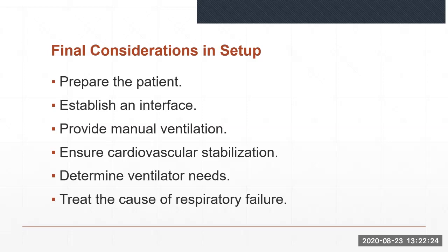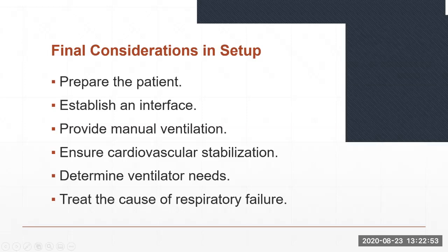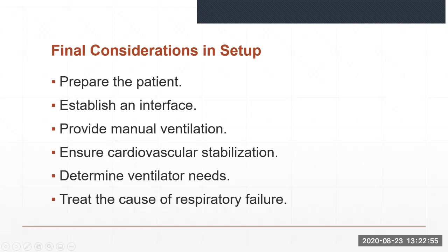After the patient's cardiovascular status is stabilized and primary ventilatory needs are being met, the clinician can then select the appropriate mechanical ventilator mode and appropriate ventilator settings. Once a life-threatening situation no longer exists, attention can be turned to treating the initial problems that cause the patient to require ventilation. Mechanical ventilation is not curative.